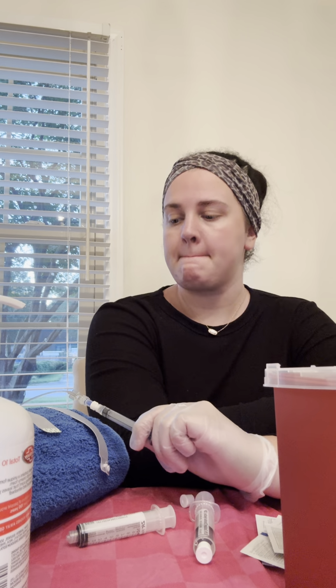And then I'll go ahead and follow that up with our 3 ml syringe of normal saline. And again, every time I'm pushing anything, I'm just reassessing the IV site to make sure no changes are happening and to make sure it is still good, and which it is. So now that that is done, I'm just going to re-clamp this PRN here, and she is good.